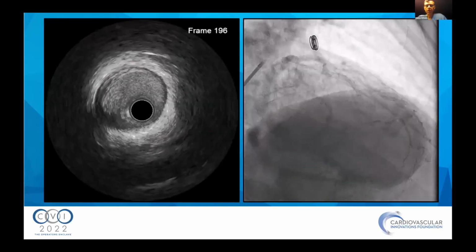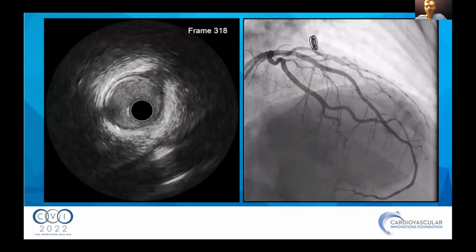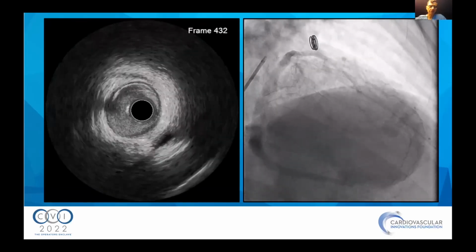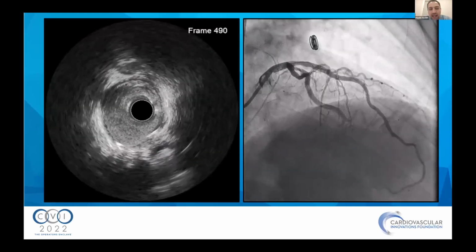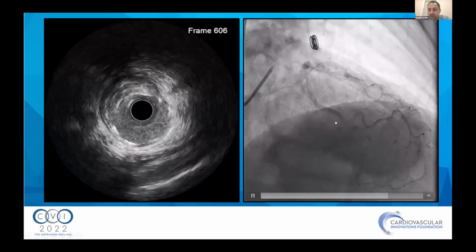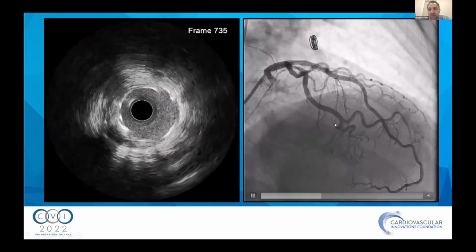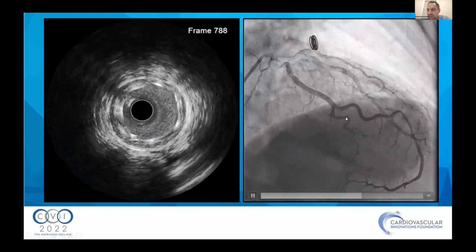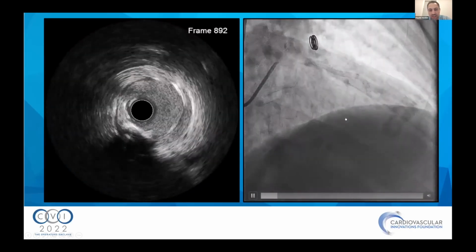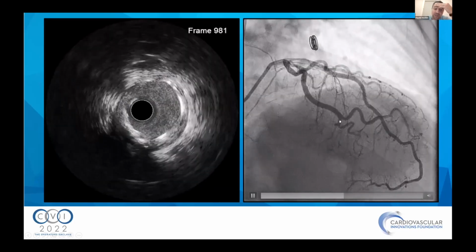That was a beautiful large hematoma, right? So it's interesting that he had such a rapid progression and such a large hematoma so quickly, but I guess it happens. Yeah. I think it's the lack of calcium. Dr. Balakis, you know this very well, much better than any one of us. In CTO, the subintimal space doesn't expand fast in calcified arteries, but in soft plaque like this, you could have a hematoma as you're still talking to yourself through the algorithm of what to do.